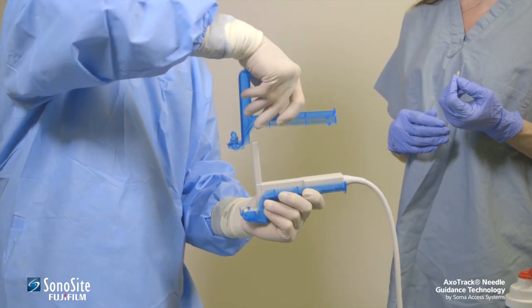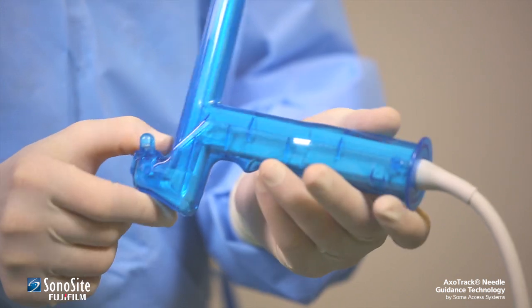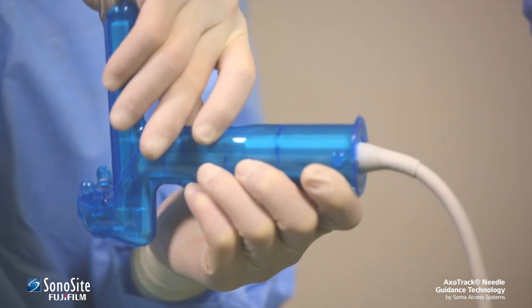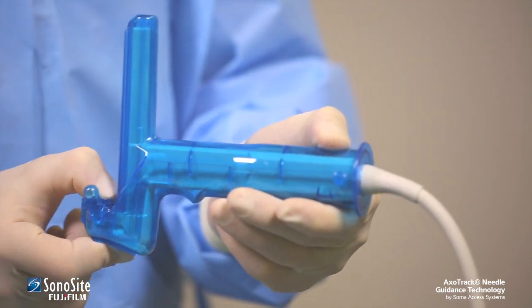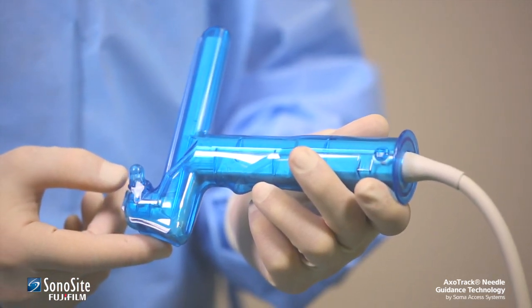The practitioner then slides the top half of the sterile shield down over the transducer and snaps it in place simultaneously in the front and rear of the shield. There should be audible clicks from both the front and the rear snap closures when the two halves lock together. The snap closures at the front and rear of the shield should be checked visually to confirm complete shield closure around the transducer.